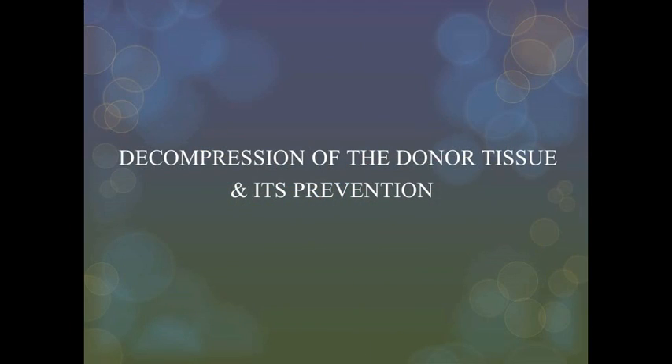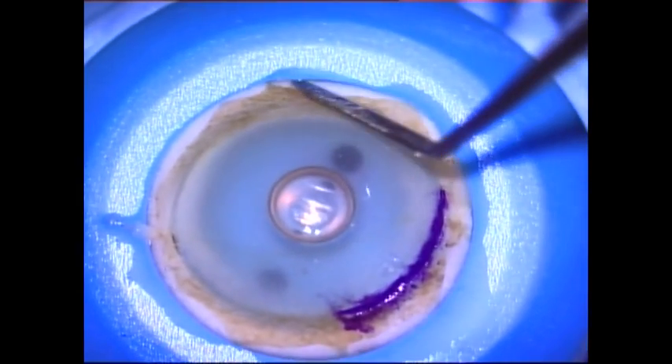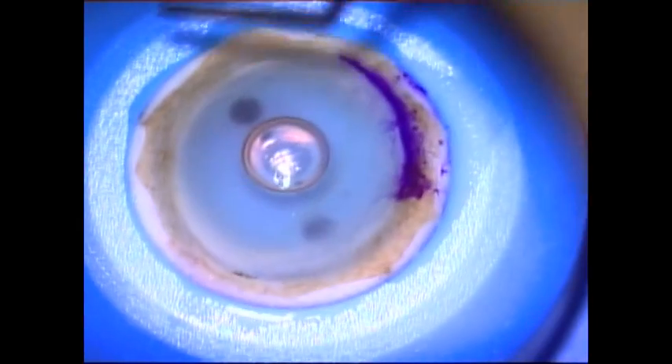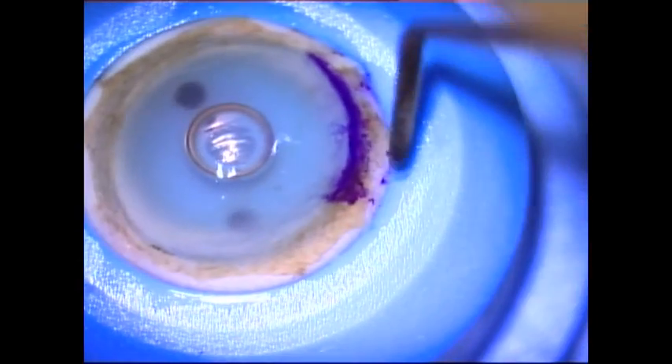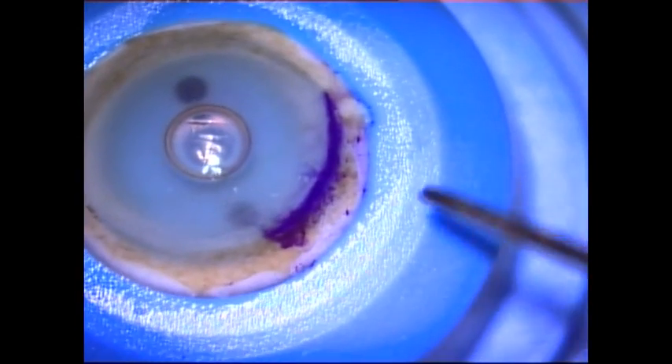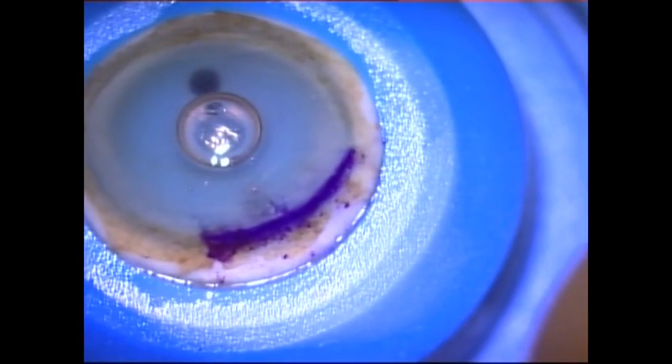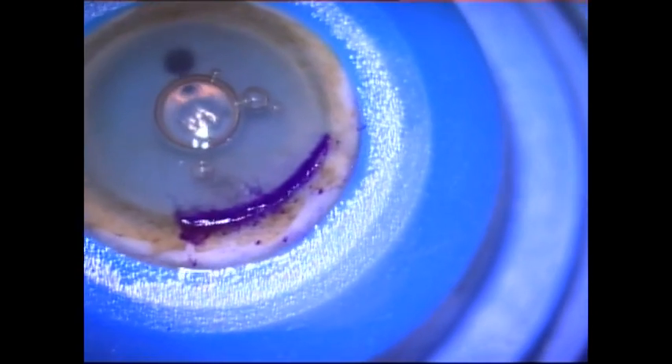While removing the corneal tissue at the end, decompression can happen. This can be prevented by a simple maneuver. An iris spatula is used to separate the donor tissue from the rim of the artificial anterior chamber all around. This is done until the donor tissue is freely rotating before lifting the rim. By doing this simple maneuver, decompression of the tissue can be avoided while lifting the rim.